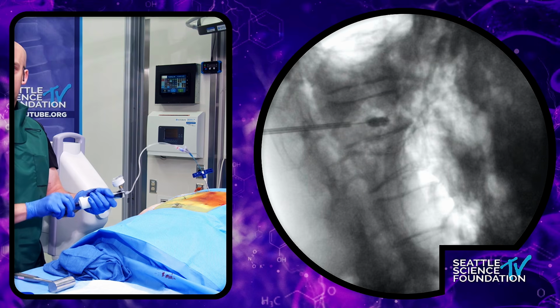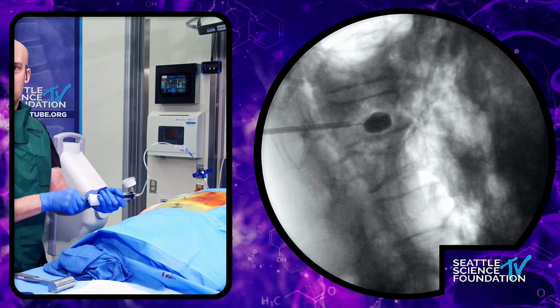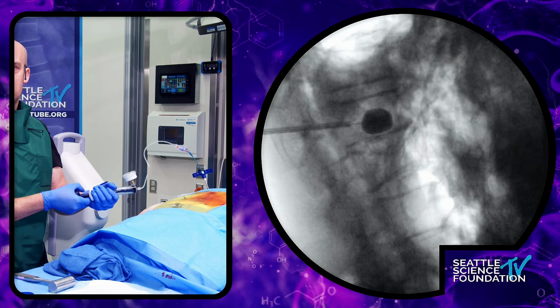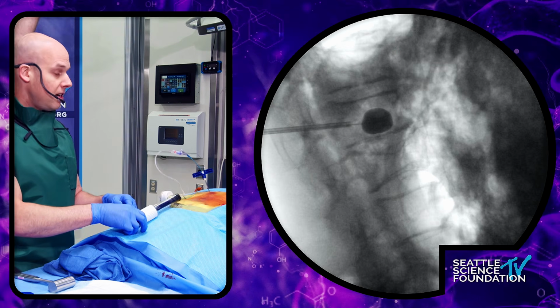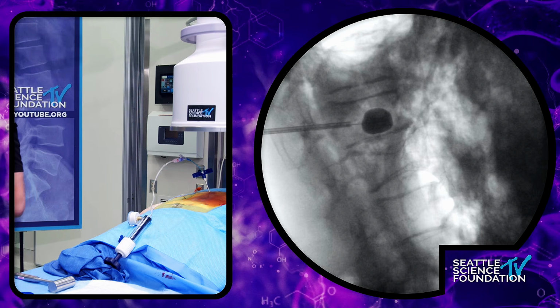And that looks fantastic. We can show what it looks like on the AP view there. It should be nicely filled in right in the center of the vertebral body.